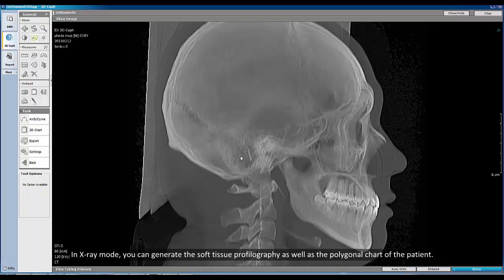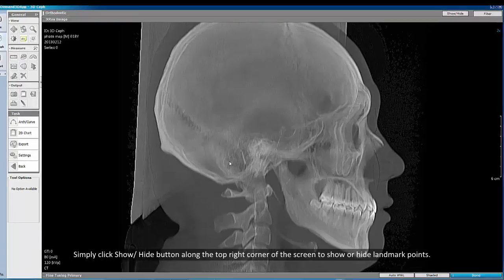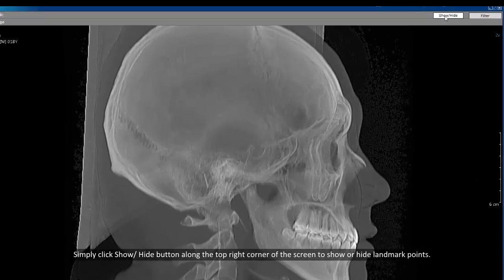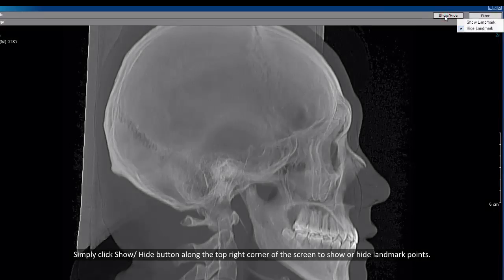In x-ray mode, you can generate the soft tissue profilography as well as the polygonal chart of the patient. Simply click the show and hide button along the top right corner of the screen to show or hide landmark points.